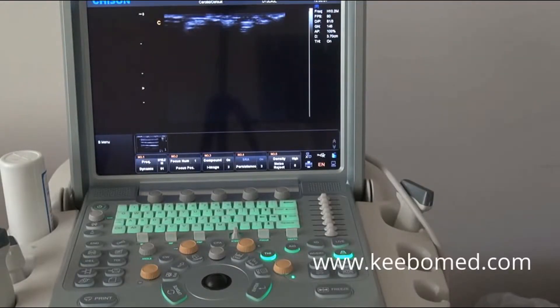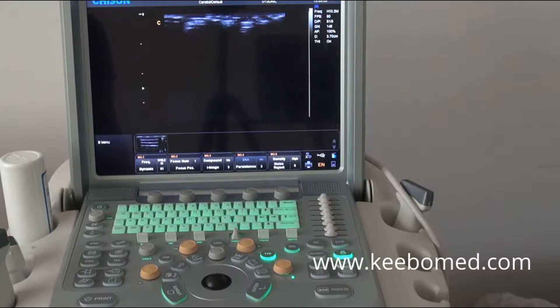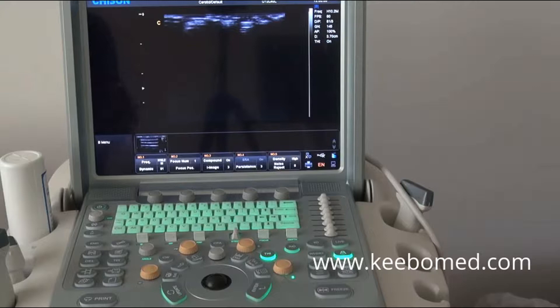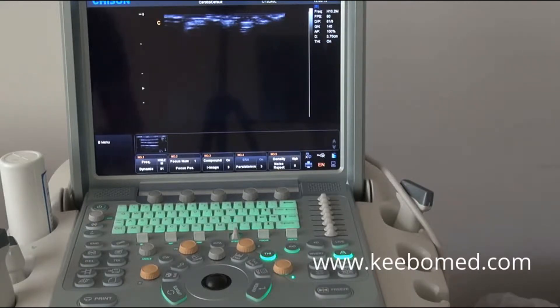Hi, this is Becky, the clinical specialist. First of all, I will show you how to open and find the cardiac functions, and next I will show you the general operation for Q9.